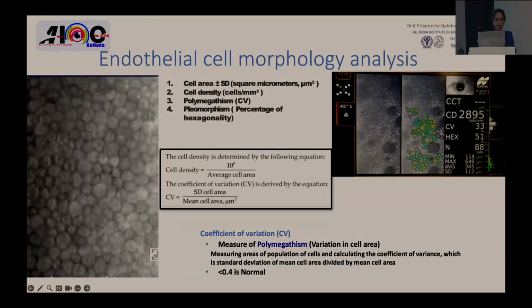And here when you look at a picture, it is self-descriptive. You see all the cells are not uniformly shaped here. They're not uniformly sized. There is a variation, and you're also finding a lot of dropout areas here, the blackout areas, which means the endothelial cells are abnormal. There is a fallout here. They're not being imaged on specular reflection, and these will constitute the guttae here.